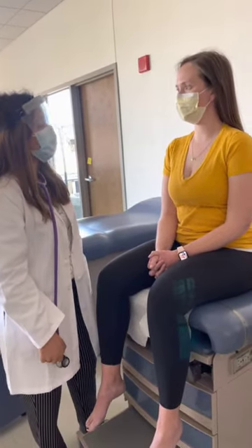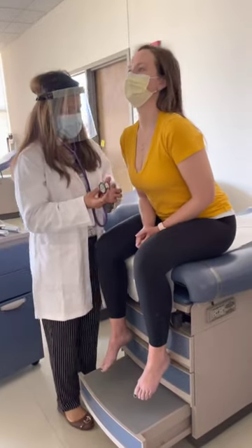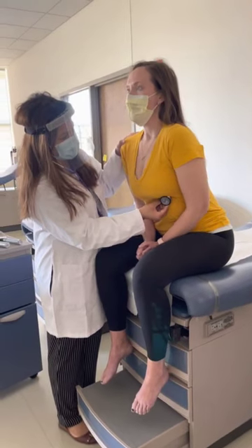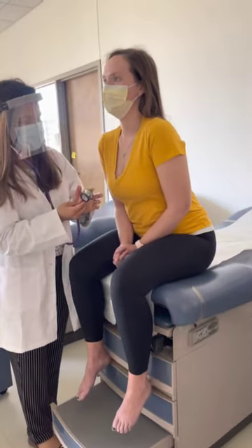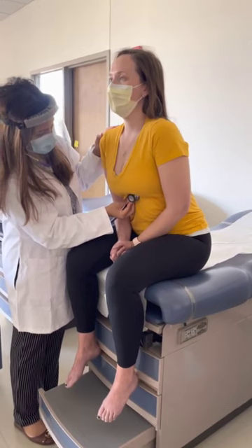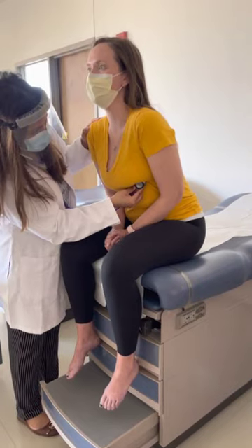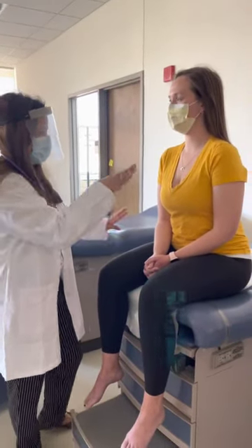I'm going to listen for regurgitations at the aortic and mitral. I'm using the bell of the stethoscope for mitral stenosis — please lean forward, take a deep breath and hold. For the aortic regurgitation I'm using the diaphragm — lean forward, take a deep breath, let it out, and hold. I'm also going to quickly listen to the left sternal border. I did not hear any regurgitation at either point or the left sternal border — that's negative.